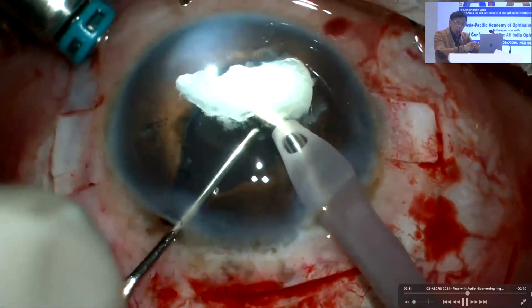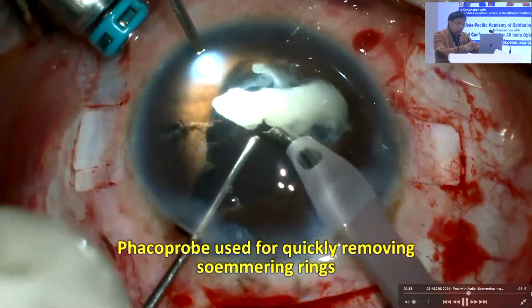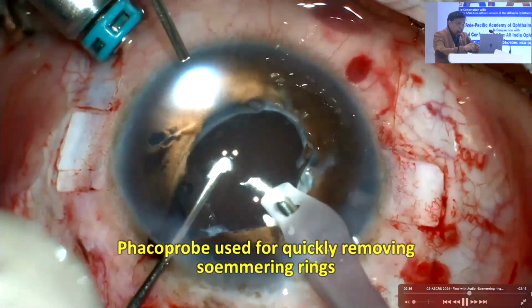See how many Sommering rings there are. They are large, they are thick. You don't want them falling down. So this is the best thing.